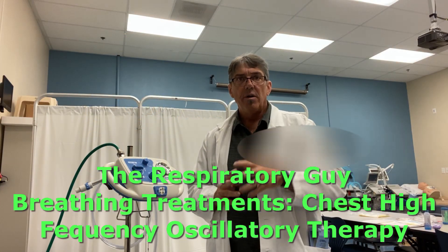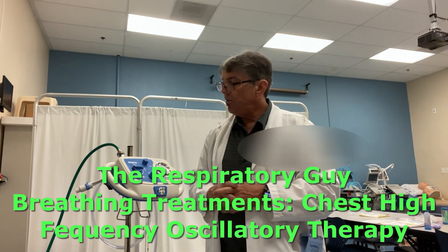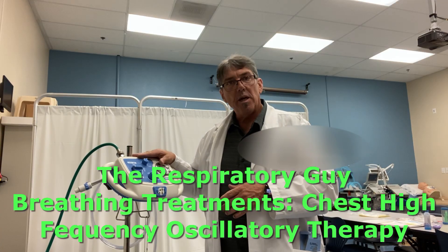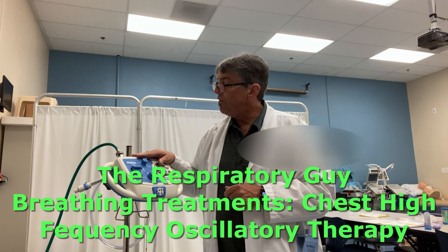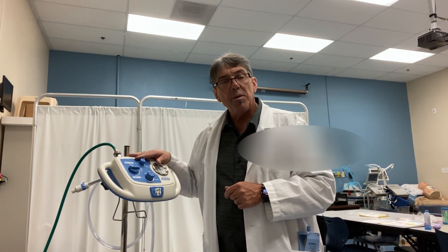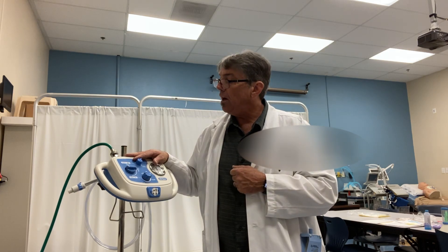Hello everyone, Chris here. Today we're going to take a little bit of time to look at the Hillrom Medinab. The Medinab is being used more and more in facilities today. It has small volume nebulizer type functions, as well as functions similar to IPPB, as well as some hybrid features where we have oscillatory frequencies that can be set up to provide vibratory type therapy along with your medication administration.